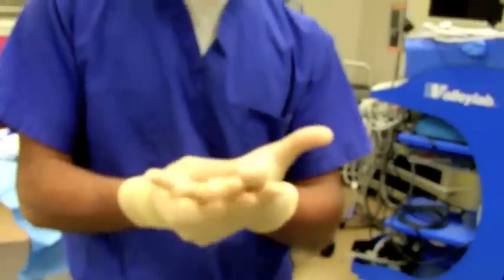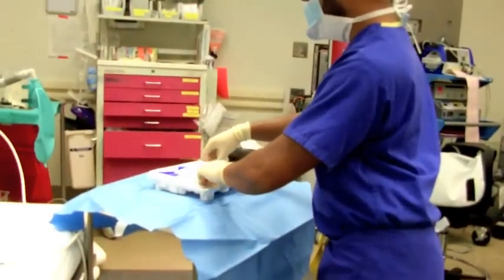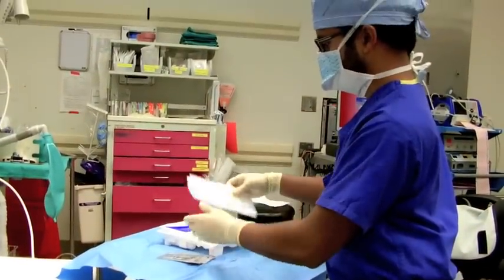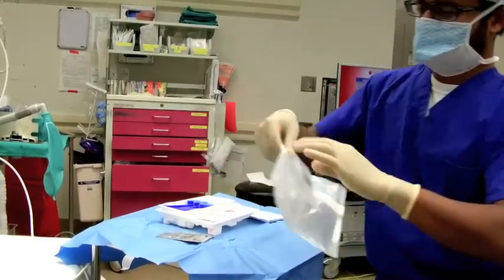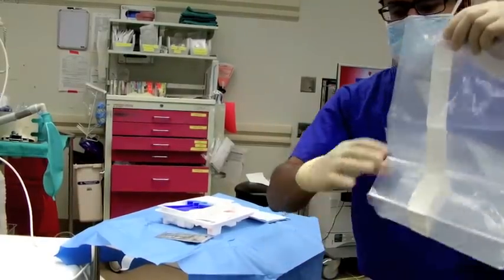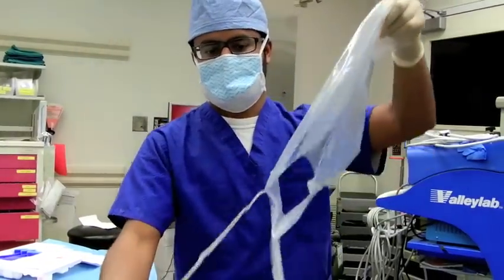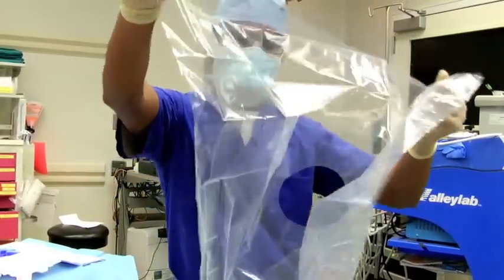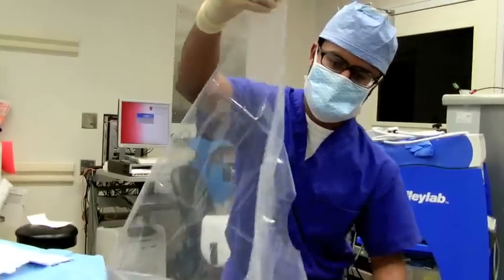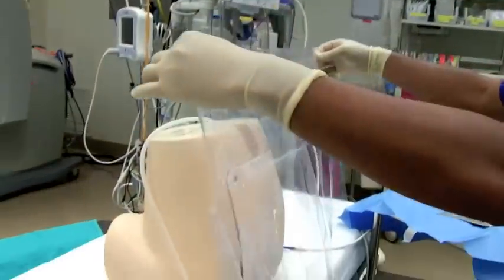In the next step, we will apply the sterile drapes. In the spinal kit, I'll locate the sterile drape, making sure to not have it touch anything else. Remove the sticker. Open it, and apply it to the patient so that the window is where I marked the initial skin.